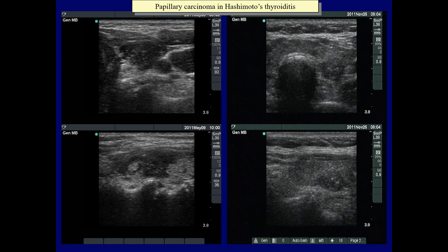Two cases are demonstrated in which Hashimoto's thyroiditis co-existed with papillary carcinoma. At first sight, the left case may be a typical presentation of Hashimoto's thyroiditis with a small intact part. Nevertheless, the larger hypoechoic lesion demonstrated in the upper horizontal scan and right to the isoechoic area in the lower longitudinal scan presents nonspecific hypoechoic granules. Compare in the lower image the smaller hypoechoic area left to the isoechoic and the larger right to the isoechoic area. The latter proved to be a papillary carcinoma.